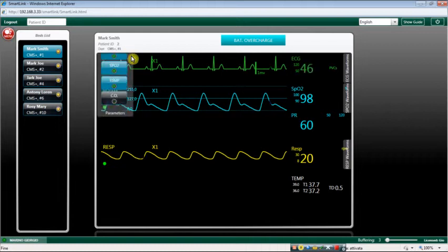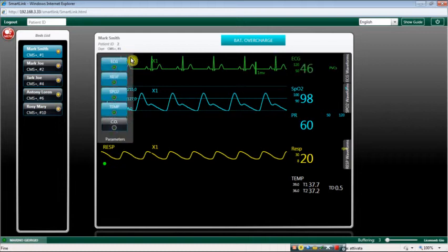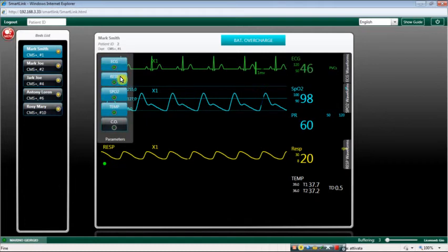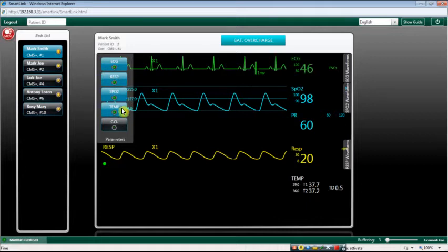Move the mouse on the parameters label to open the parameters list. The parameter set is the same as the selected patient's monitor. Different monitors can have different parameter sets.